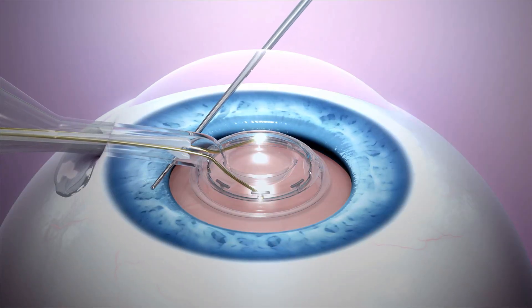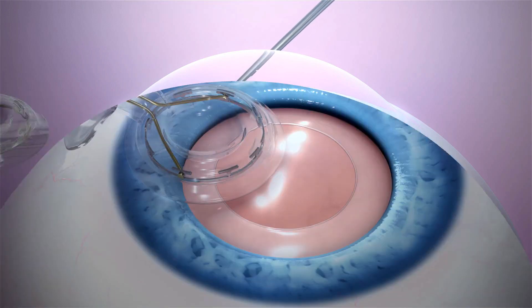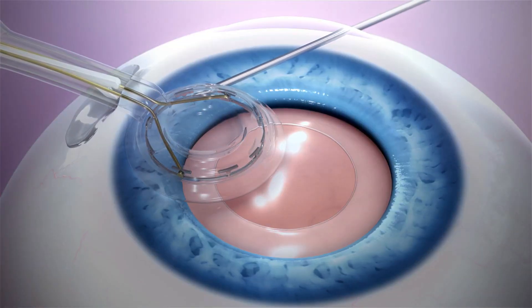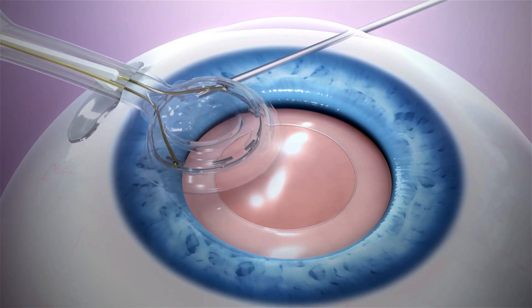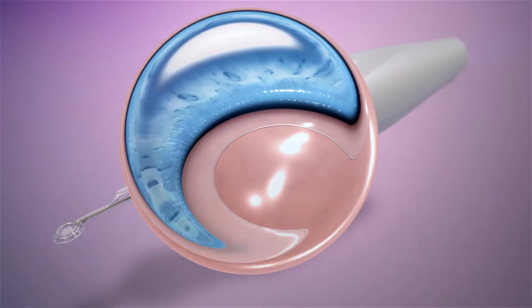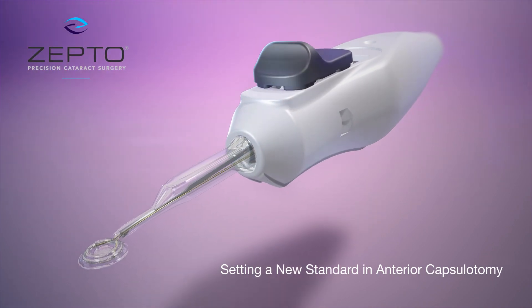If needed, a second instrument may assist through the side port. An additional viscoelastic can be applied to push away iris tissue. Zepto: setting a new standard in anterior capsulotomy.